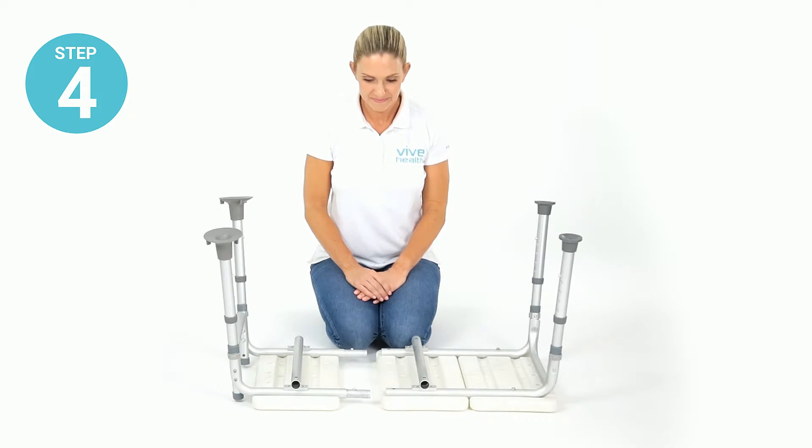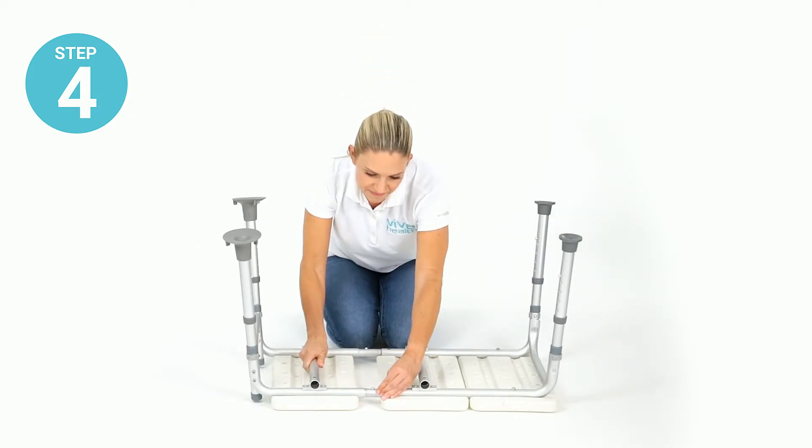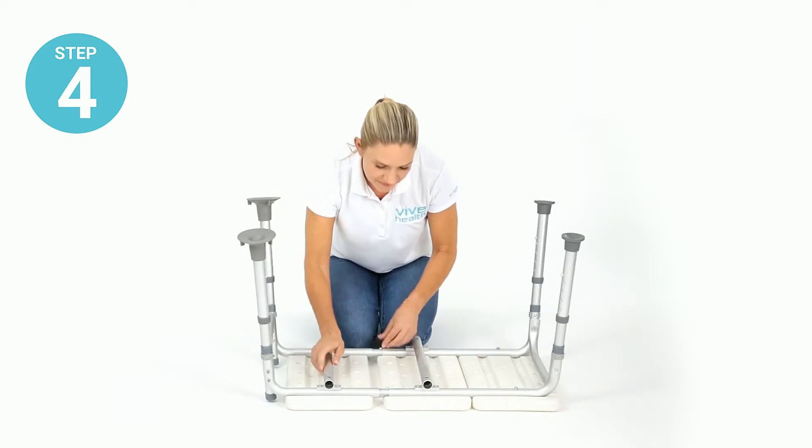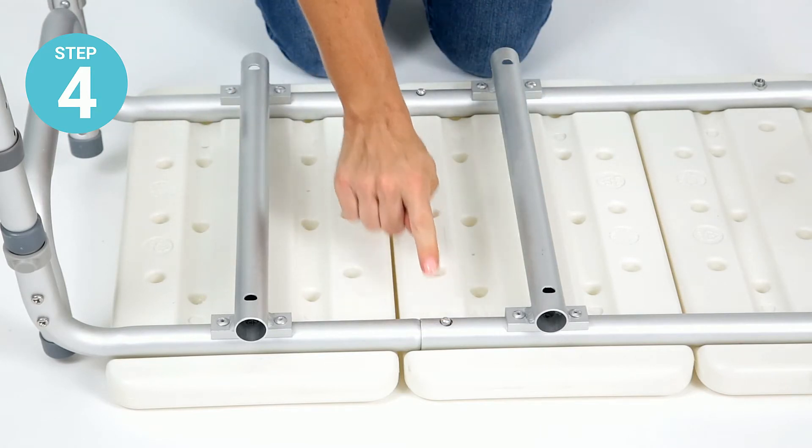Step four: connect the small seat section with the large seat section by depressing the locking pins and pushing the seat sections together until the pins pop into place.